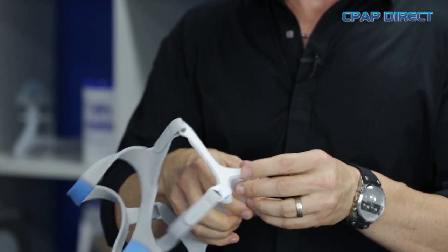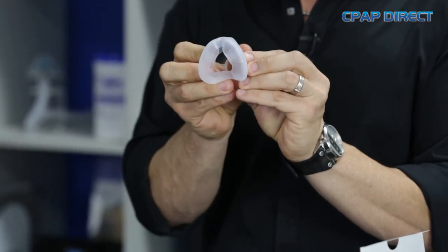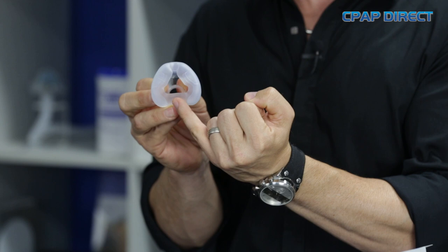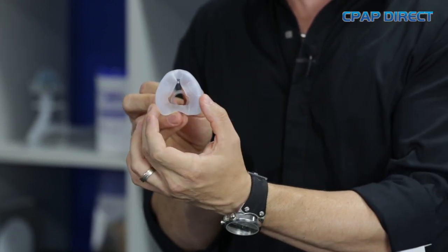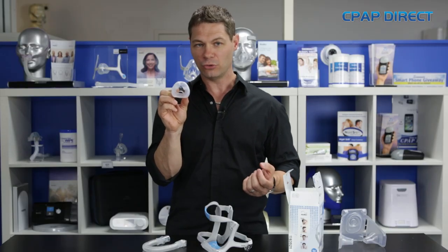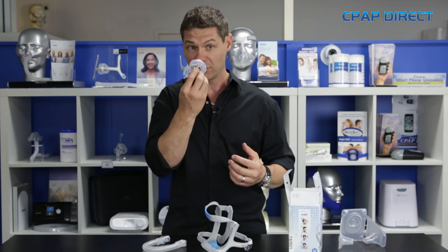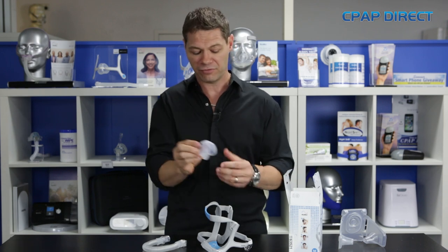The cushion on the N20 is a new design. They've made a really soft part for the bridge of the nose and also underneath on the top of the lip as well, maintaining the firmness around the edges. The upside to this mask is you can get a really, really good seal without it being tight at all. Some people have called it an infinity seal because of the way that it sits on the face. Really snug, very comfortable to have on the face.